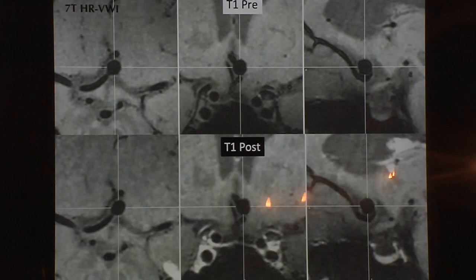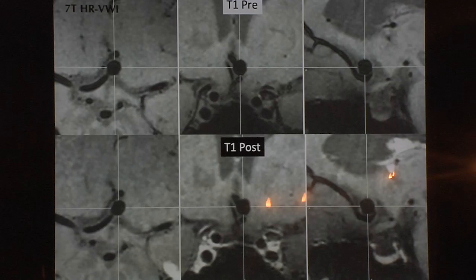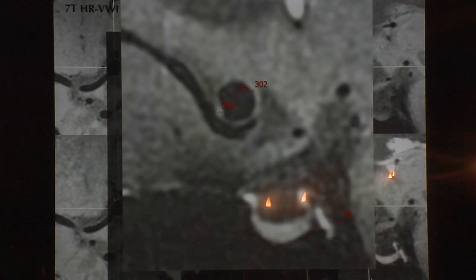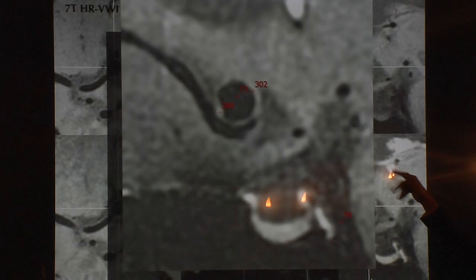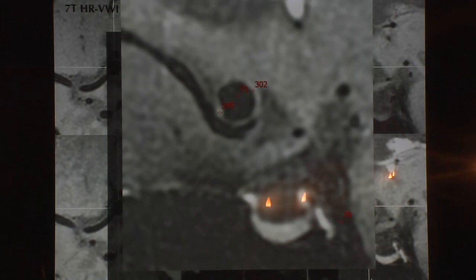This is one of the 7-Tesla aneurysms we imaged. We have different views — on the far right the axial, then the coronal and sagittal. On the bottom row you have T1 pre and T1 post. At first you don't notice much difference between pre and post. But when you magnify — that's why we use high-resolution — you can see the particular enhancement of the aneurysm. We start measuring the enhancement: for example, the measurement in one part of the aneurysm was 349, while in the sac it was 73, and the posterior wall was 302. We start noticing these differences with 7-Tesla MRI imaging.